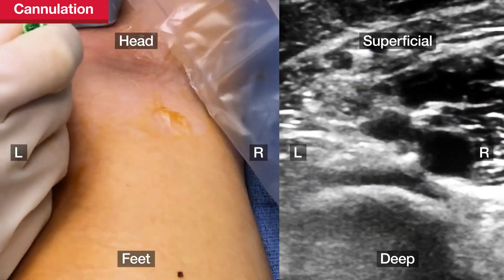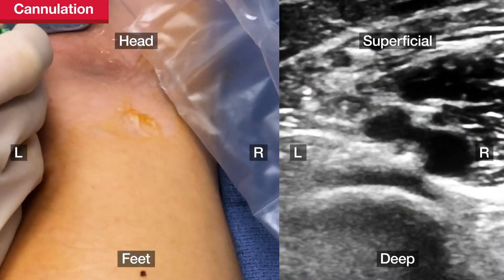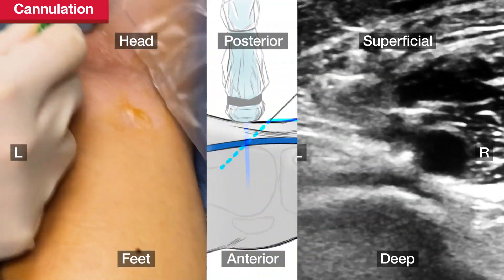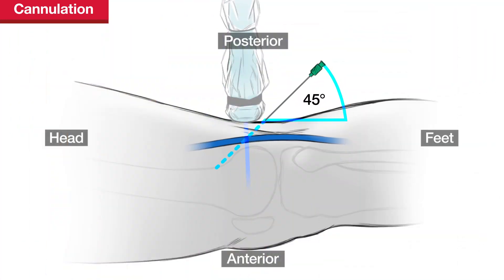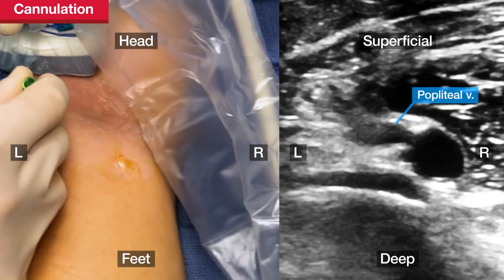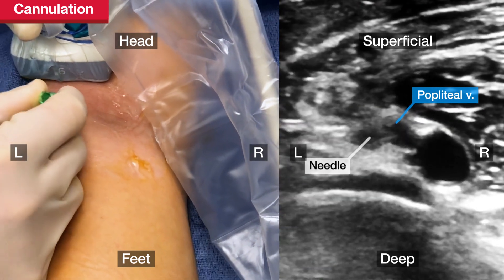Next, puncture the popliteal vein with the micropuncture needle at a 45-degree angle, beginning about one centimeter away from the transducer. This distance from the transducer can be variable as it depends on the depth of the vein, but entering away from the transducer allows visualization of the needle tip on the ultrasound.